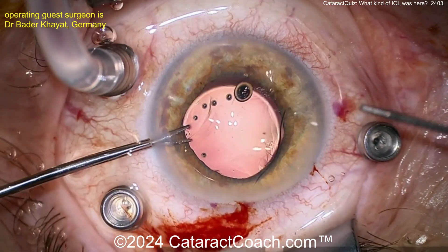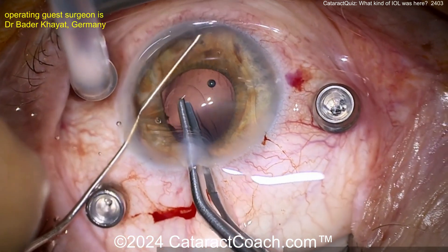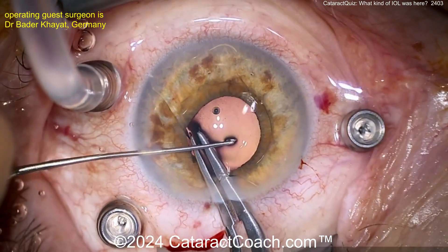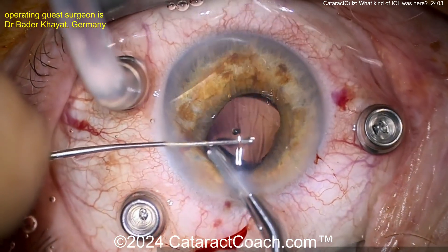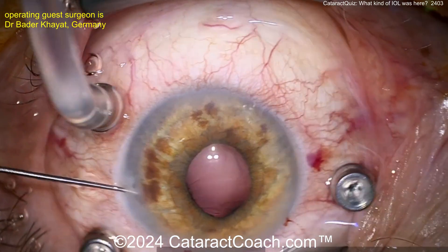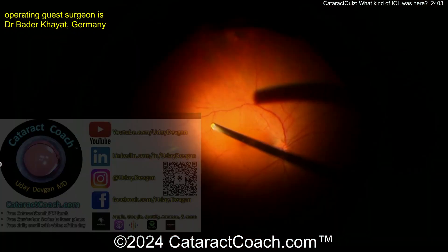Surgeons are bringing the lens up into the anterior chamber — there it is. Let's see if it can be folded or compressed. And it just pulls on itself, folds on itself — all right, lens is gone.